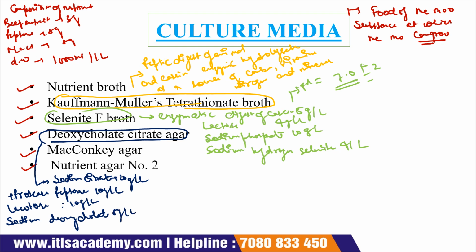It also contains ferric ammonium citrate, okay, and neutral red, and finally it contains agar. The amount of agar is around 13.5 gram per liter.